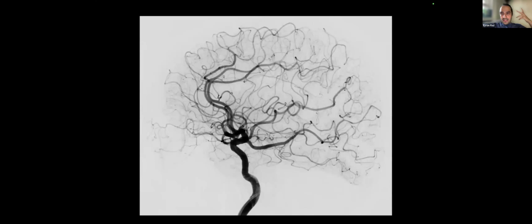It was a right eye issue, so I wanted to be extremely safe with the procedure. I just went to the right ICA, and you see something, which whoever does this knows: the fact that you see the choroid blush doesn't mean that the central retinal artery is not occluded. So first, an anatomical, very important message, right?